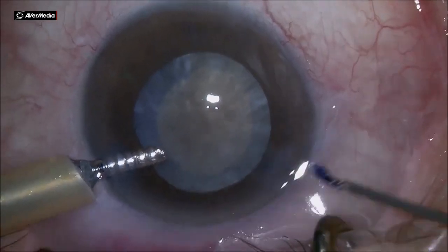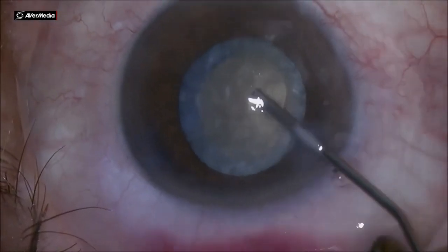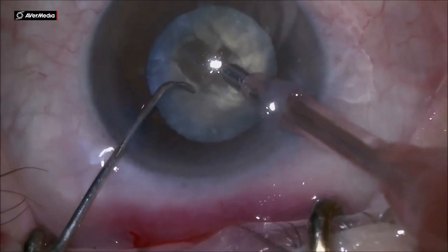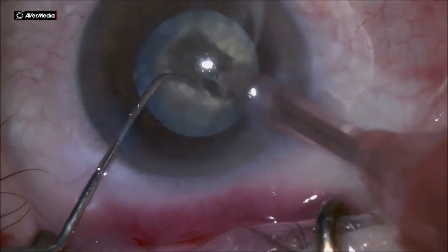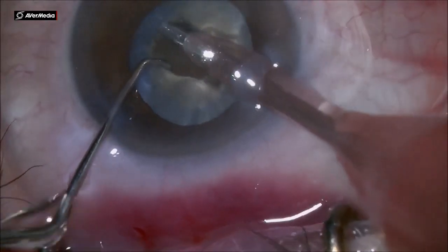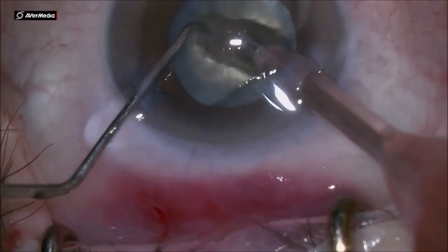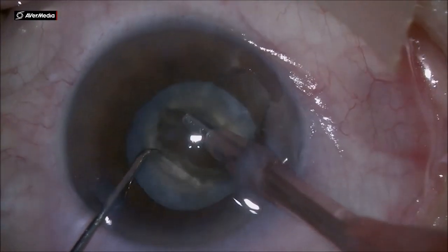I was surprised to see how hard this nucleus was — a leathery one. Initially it didn't appear that tough from the cortex, but after the first part of using the phaco probe, I realized how hard the nucleus would be. It's like a leathery brown cataract. The phaco probe has a very hard time to chew this leathery brown-black type of cataract, but it's a challenge that we can take on under phaco emulsification also.